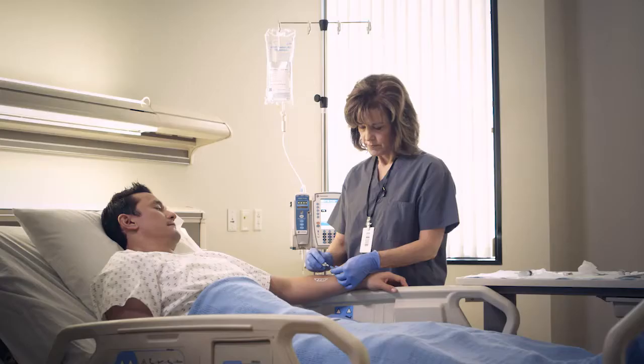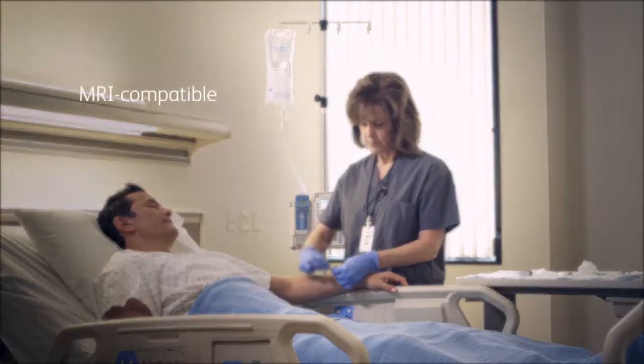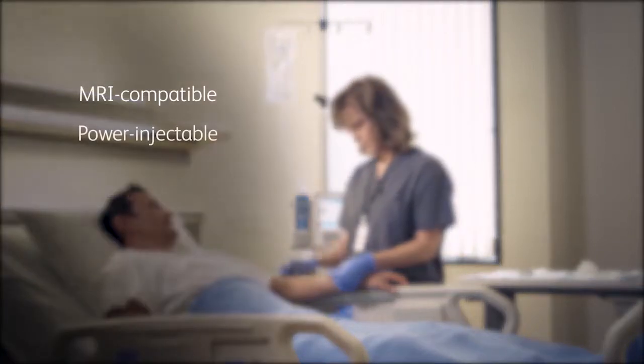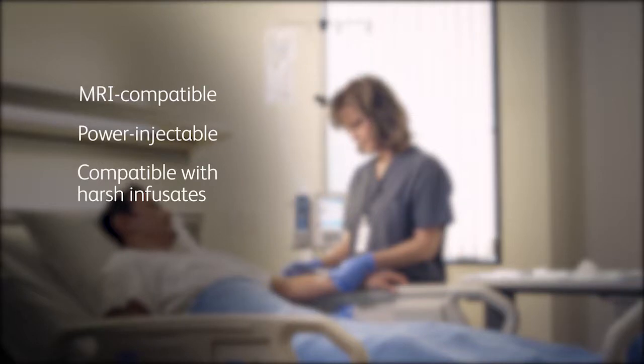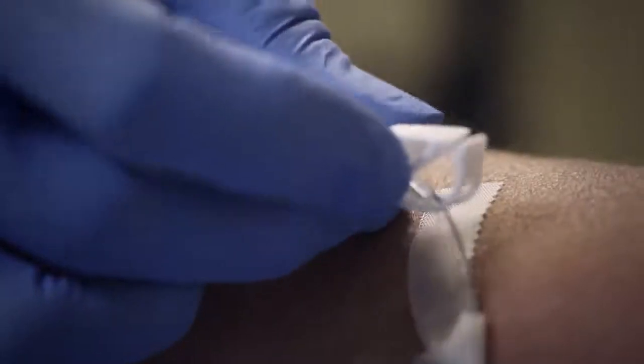Always trace your line prior to connecting to a device to avoid a misconnection. The MAC-Zero is MRI compatible, power injectable up to 325 PSI at 10 mL per second, and compatible with harsh infusates including chemo and lipids. Unclamp the catheter or extension set prior to accessing the connector.